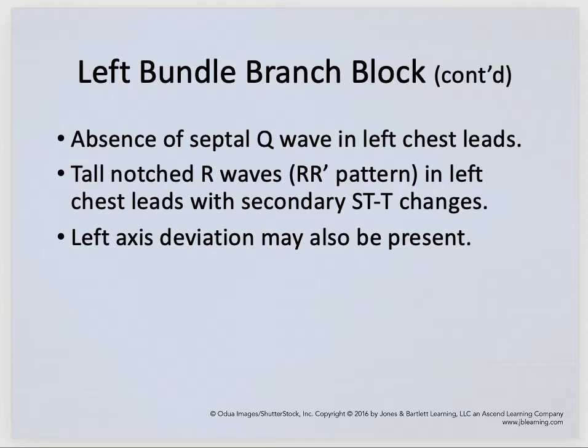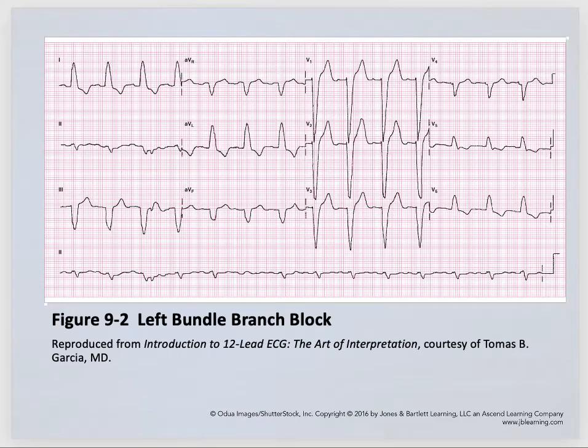Remember left axis deviation, right? So remember how to do axis deviation, what's going on with lead 1, what's going on with aVF, all of those things. Okay, so let's take a look at what this looks like on the EKG.